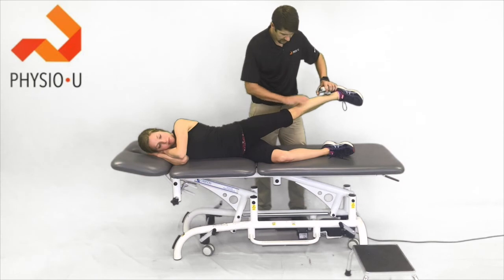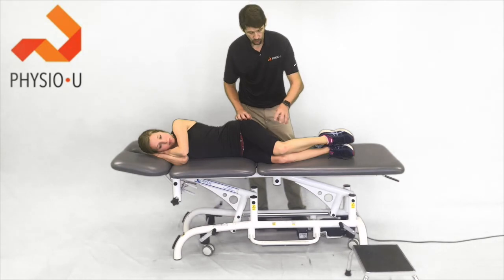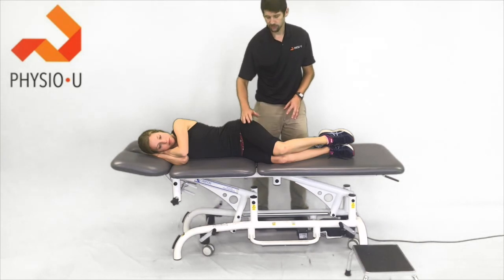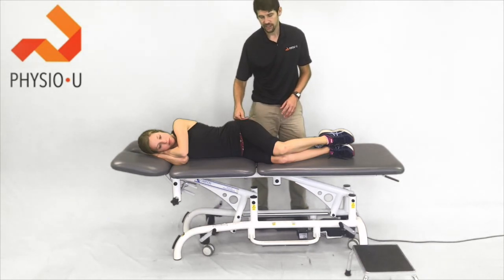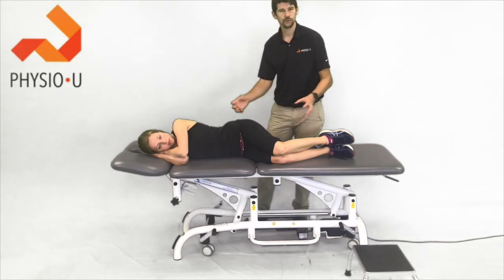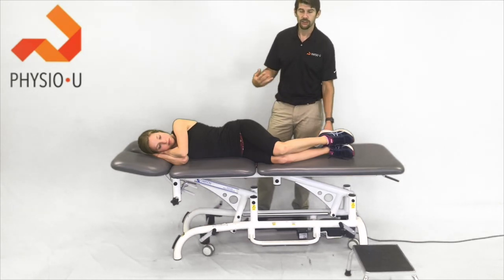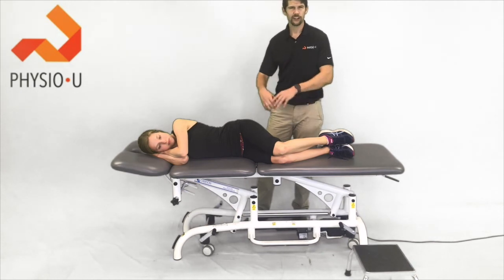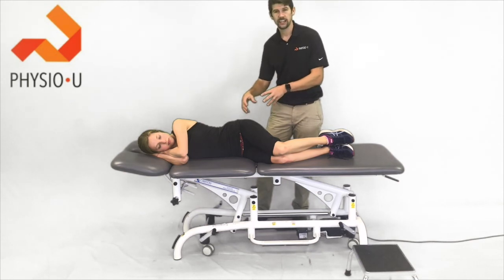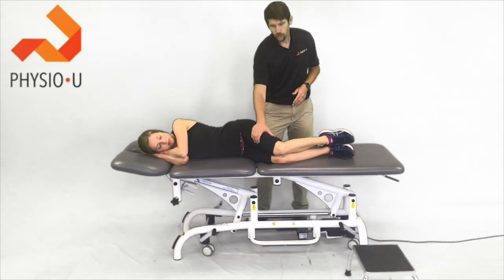A couple of studies from 2016 and 2014 that looked at hip strength in patients with hip and knee pain found up to 24% weakness in those hip muscles — the abductors and external rotators — compared to the non-involved side. The nice thing is, if we're going to strengthen these muscles, which we often do with many of our patients, we want to get a quantitative number so when they come back we know if they're any stronger: did they get better without a change in strength, meaning it's more of a motor control issue, versus building an extra 5-10 pounds of strength?